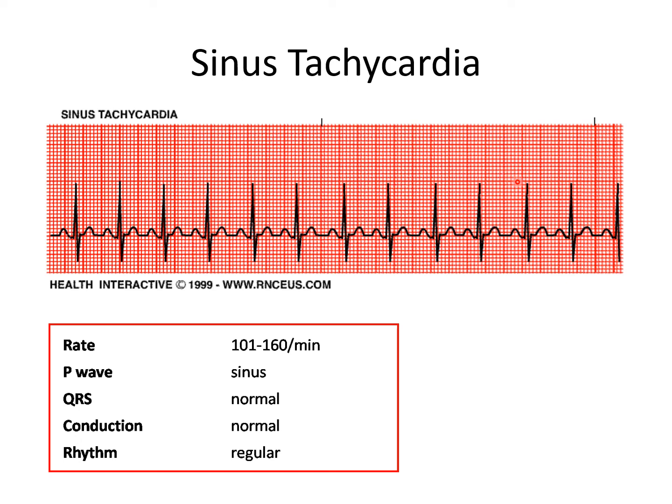One other mention, if there's a tiny little bit of variation or slight irregularity, that's not an issue. None of these hearts are perfect as we may have them drawn out in a diagram in a textbook. So we do give a little bit of wiggle room for these rhythm strips. Don't be too exact. It's just not that important.